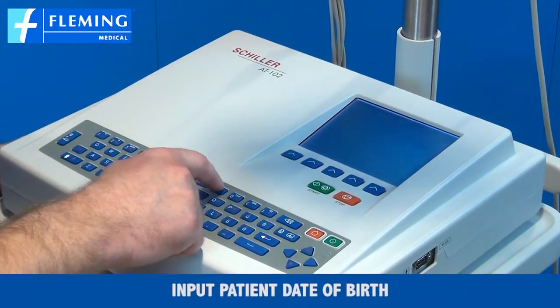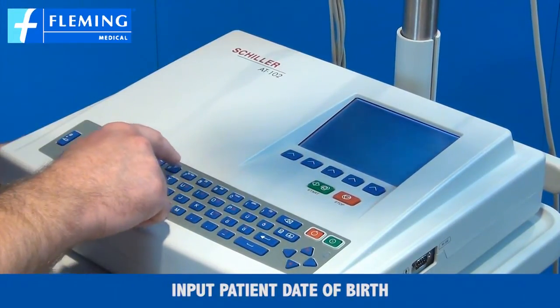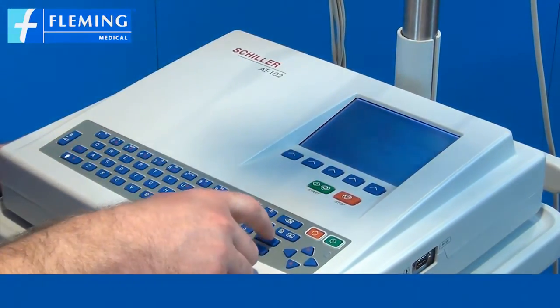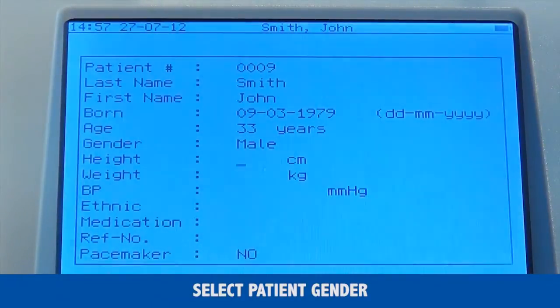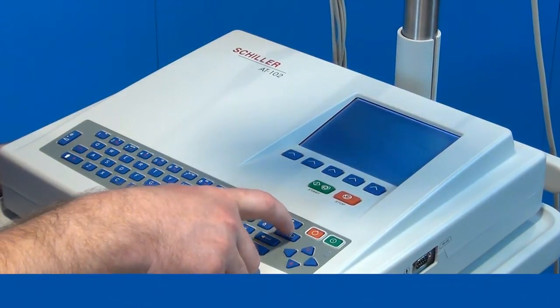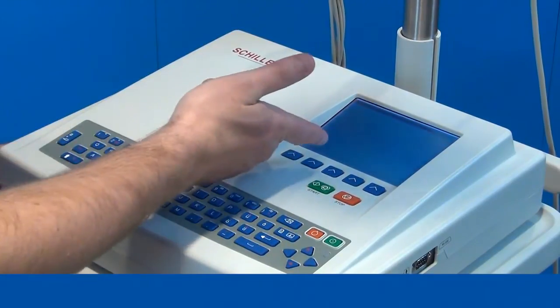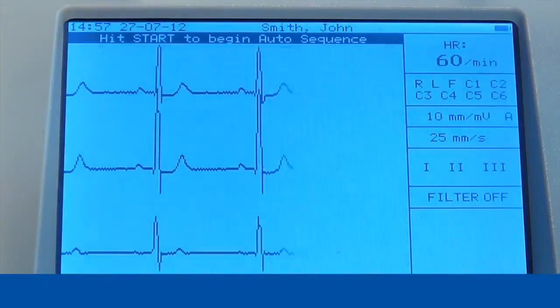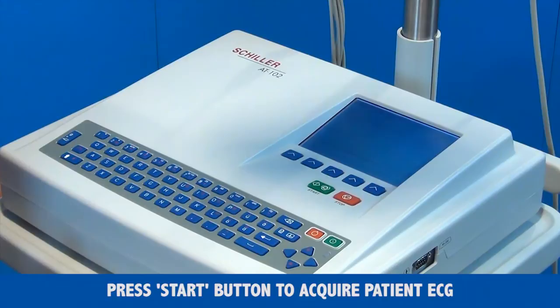Then enter the first name and date of birth. The age of the patient will automatically come up. Select the gender of the patient. Now we have entered our patient data. To get back out we press the same button, which brings you back to your ECG screen, and to acquire the ECG we press the start button, which will have the patient data on the printout.